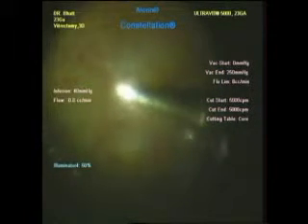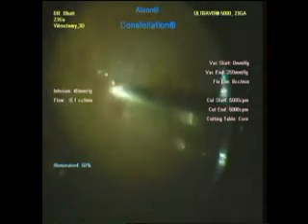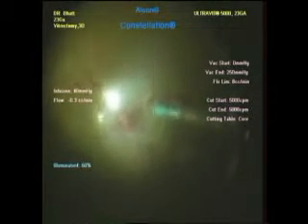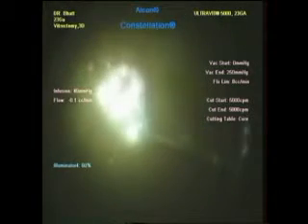After total fluid-air exchange, we use fibrin glue — one drop each of the two solutions — which is put under air over the disc. We see within 30 to 40 seconds it starts forming a reticulum which acts as a membrane to stop the oozer, and we can see a definite membrane forming. If the membrane extends much beyond the disc, intraocular forceps can be used to gently grasp the edges of the membrane and to retract it over the disc.